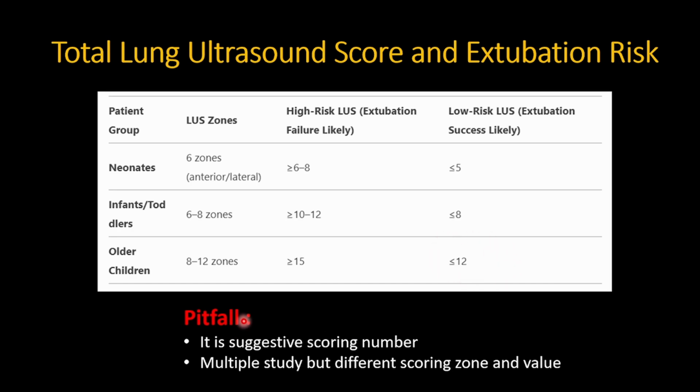The pitfall is that it is just a suggestive scoring number. And unfortunately there are multiple studies, but different scoring zones and values are given. Okay, so this is basically based on bedside scoring, and also based on how many areas you scan.